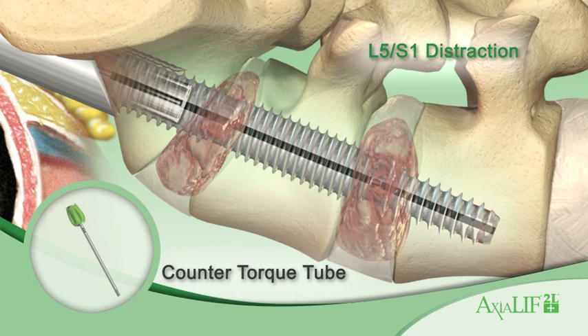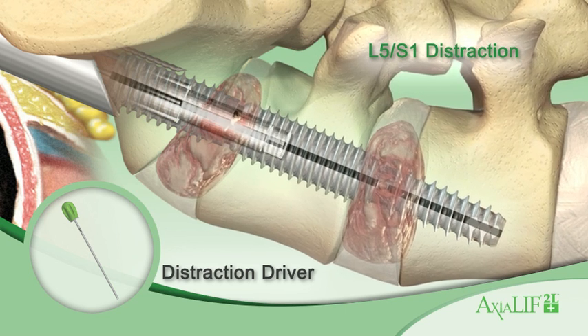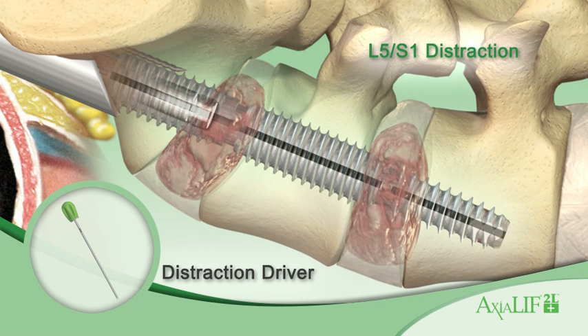Use the counter torque tube and distraction driver to advance the internal distraction rod. They are designed to distract the L5-S1 vertebral bodies, restore disc height, and indirectly decompress the neural foramen. The S1 anchor remains stationary in the sacrum during the L5-S1 distraction.